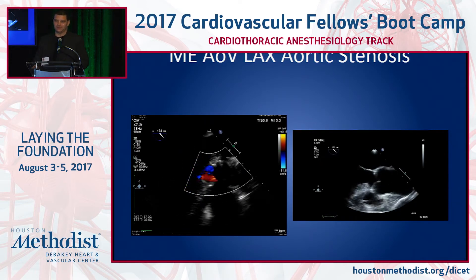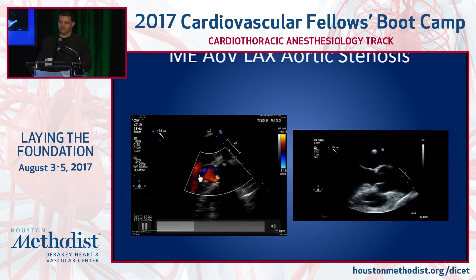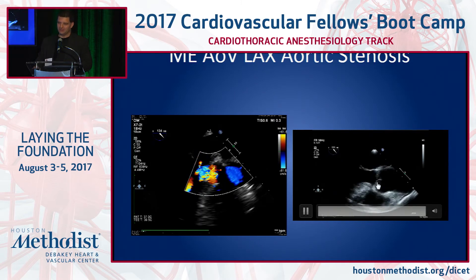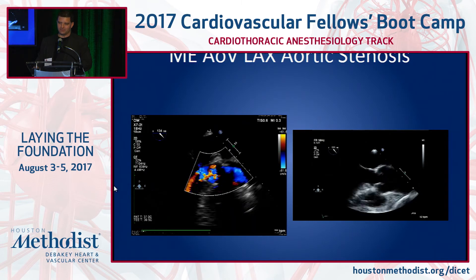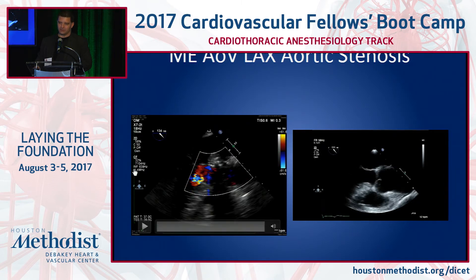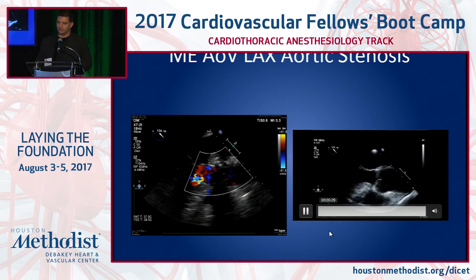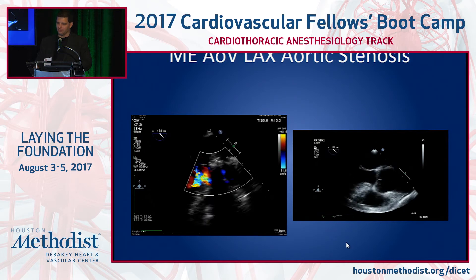Long axis aortic valve — same thing, aortic stenosis. You're going to see the leaflets on this side opening less well than in the normal one. It is associated in this particular image with some aortic regurgitation.